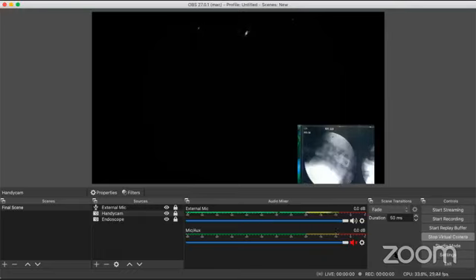Yes, can you rotate the image, please? Make it straight, please. Yes, correct. So you can see the T1, C7, C6, and C6, C5. My lower needle is on the lamina of the C6, and the upper needle is crossing the lamina of C5 and coming to the spinal lamina junction. So I'm quite happy with my positioning.